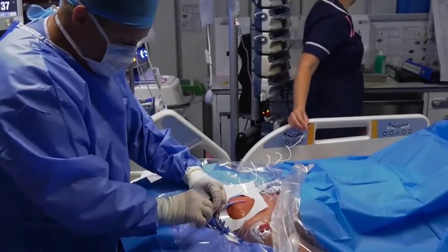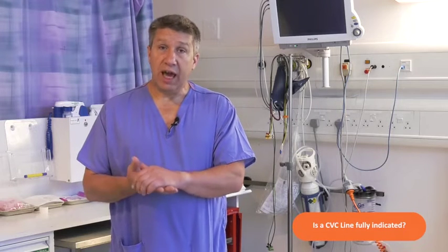When considering placing a central venous catheter or centrally inserted central catheter, it's always important to understand the indication for that catheter. Is it worth considering if there are other alternative intravenous routes that may avoid the need for a catheter altogether? If we've decided that there is a clear indication for a central line, we first of all need to make sure that the patient, if they're awake, has undergone an informed consent process.